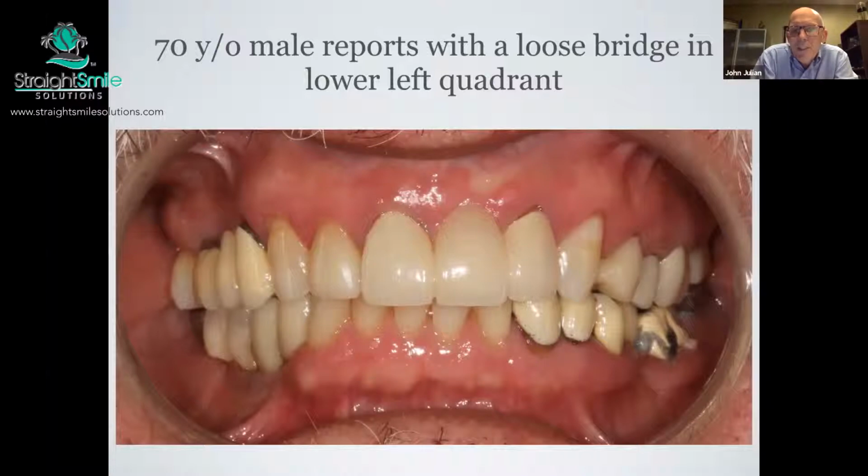He said, well, he just didn't feel like he was getting an answer to all of his problems, and things seemed to be adding up. So we said we'd like to take an X-ray. He told us that he just had one taken recently, and in fact, he brought it with him. We told him we would like to get some more information, a little more detail. So we took this film of cone beam at no charge.